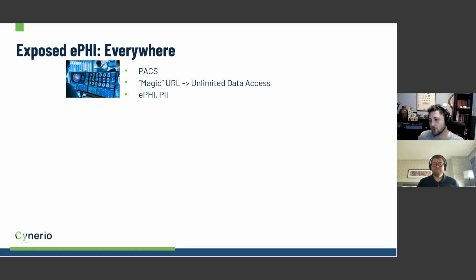You are in complete control of all of the personally identifiable information in there, all of the PHI in there, and there's a lot. This is probably one of the hubs of PHI in any hospital system. It contains both images and static data that is associated with patients. This is not good, right?